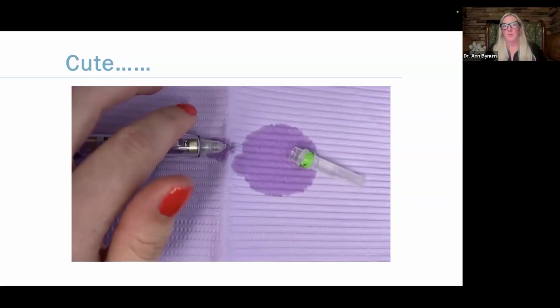So one thing that does happen with the SOAN, we've got 30 employees in our practice. There's a million hands touching these devices all day, every day, and they get switched from cruise to drive and drive to cruise. So all of us as doctors have to be privy to how to use them in either setting. But you just got to remember when you're in cruise, you tap it to start it, and you got to remember to tap it to shut it back off.